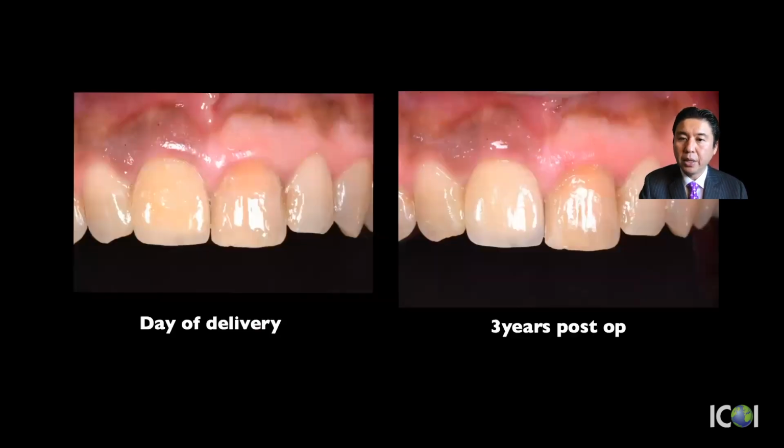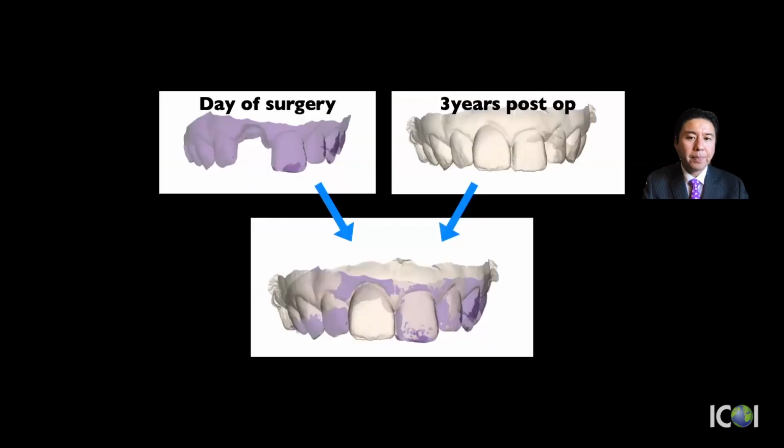Okay, day of the delivery and 3 years post-op. And then I want to do the measurement between the day of the surgery and 3 years post-op, how much change we have. Because Dennis Turner told us, bone graft without the provisional, sometimes you will get minus 5 millimeter reduction on the bone.